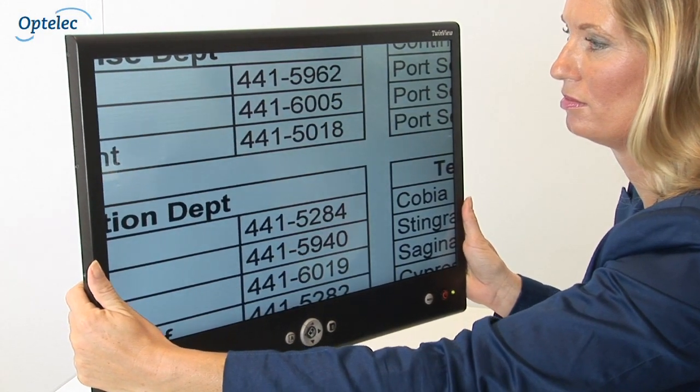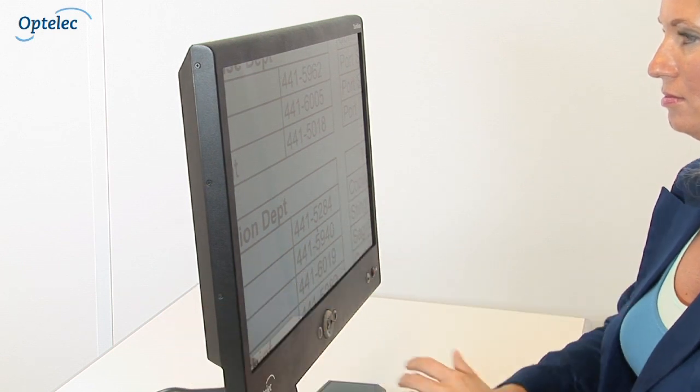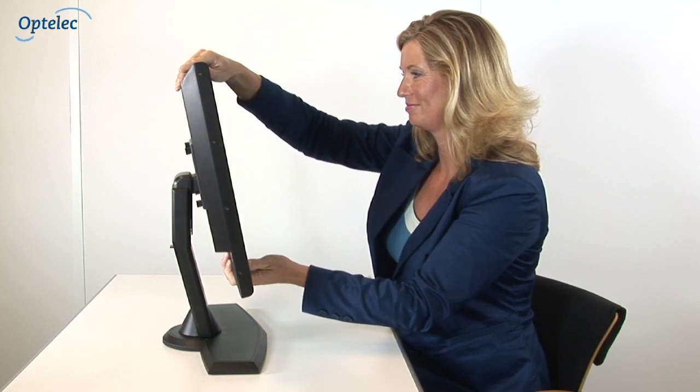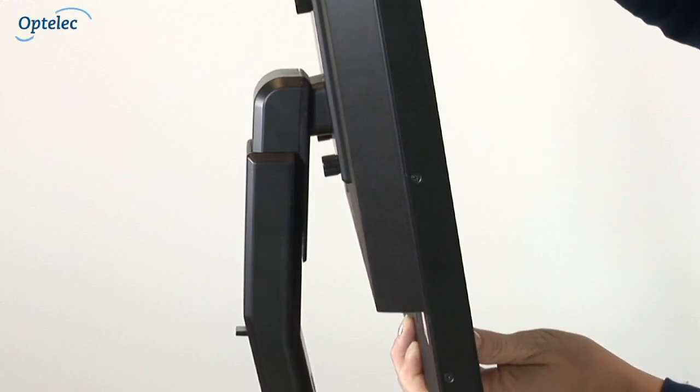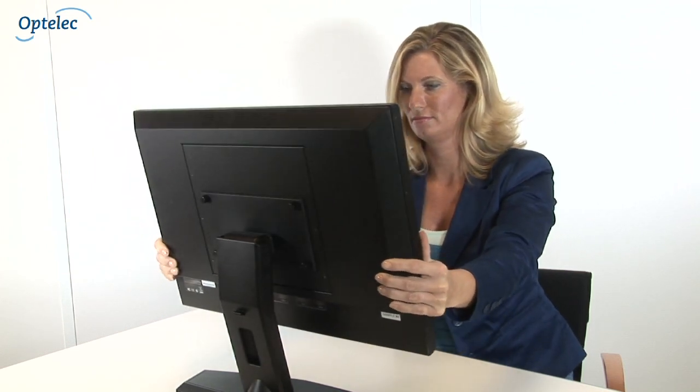You will always see a clear and sharp picture, regardless of what angle you view the monitor from or when sitting in close proximity to the screen. The monitor stand provided with the TwinView is height adjustable and allows you to tilt the screen both horizontally and vertically for a more comfortable reading posture.